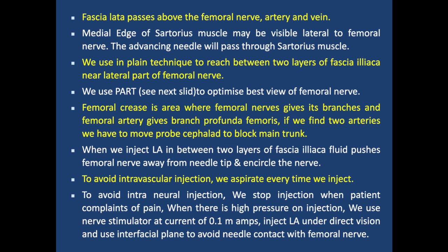Medial edge of sartorius muscle may be visible lateral to the femoral nerve. The advancing needle for the block may pass through the sartorius muscle to reach the femoral nerve. We use in-plane technique to reach between two layers of the fascia iliaca near the lateral part of the femoral nerve. Our needle is never directed to the nerve itself, but to the most lateral part of the nerve to reach between the two layers of the fascia iliaca.